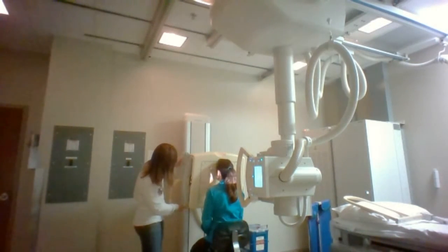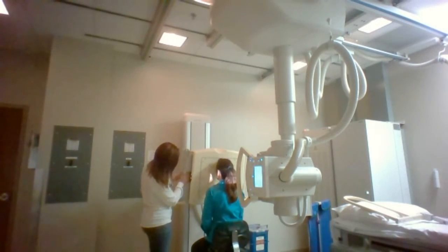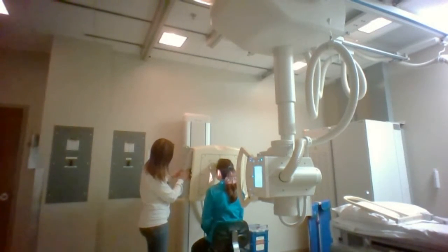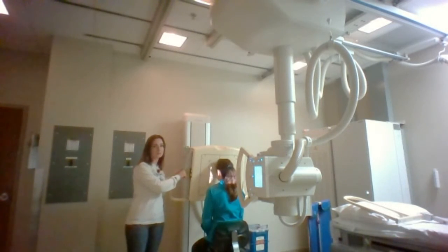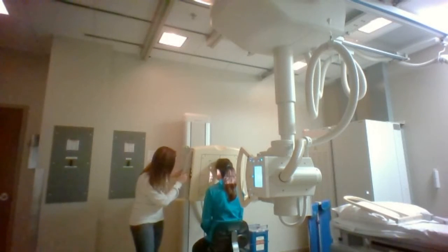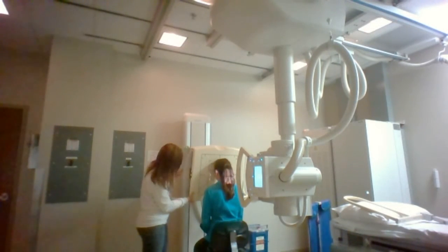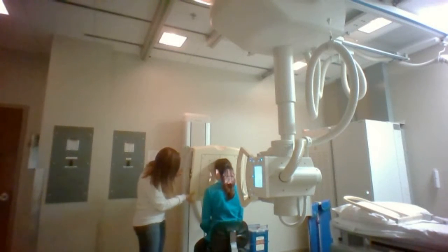Okay, I'm just going to raise this up. So for this projection, it's important to have your central ray exit the nasion. So I actually got it right the first time. Let me bring this down. I'm going to bring it right there.